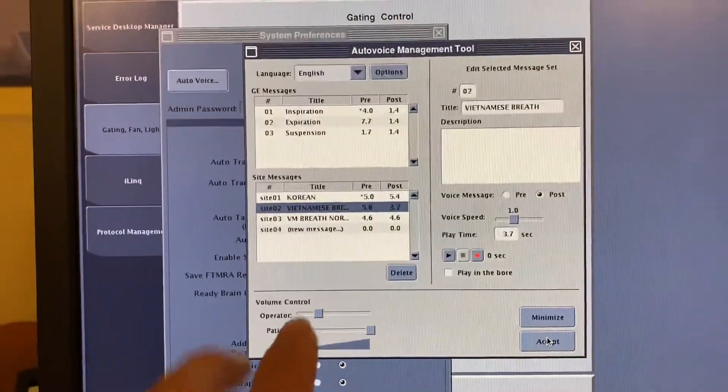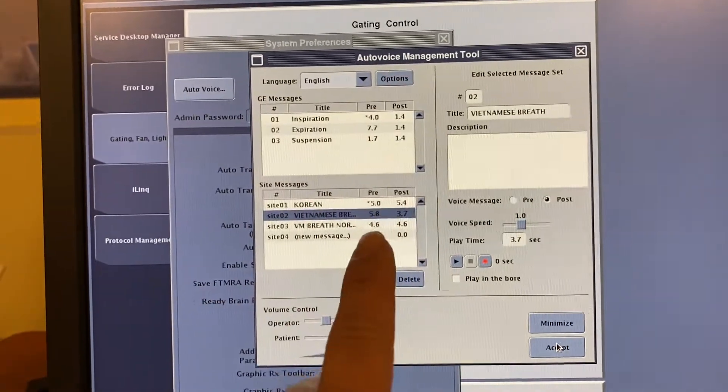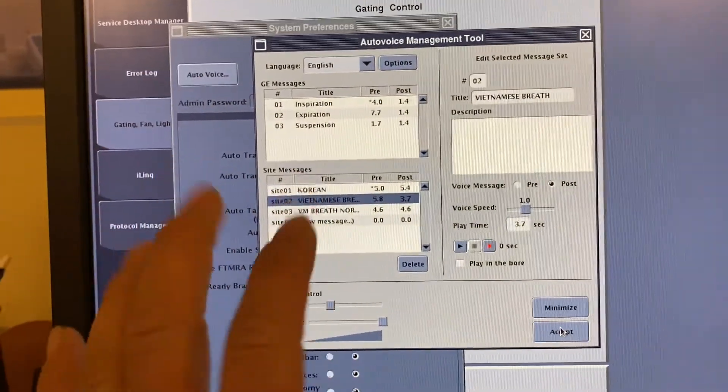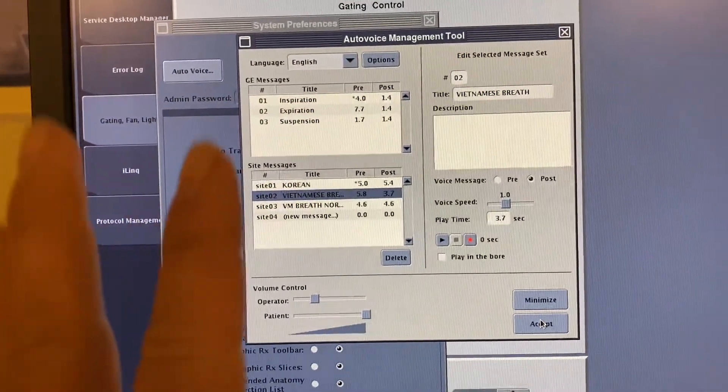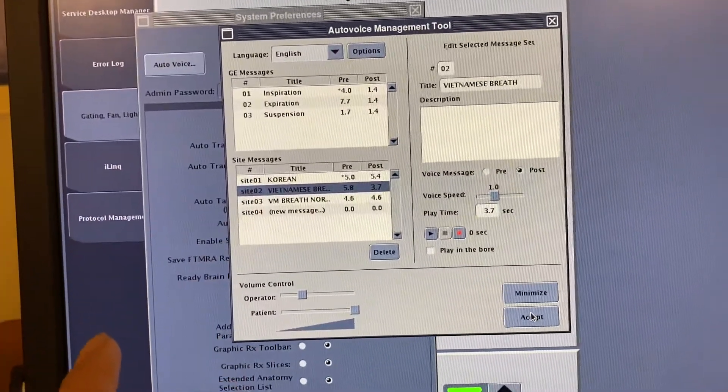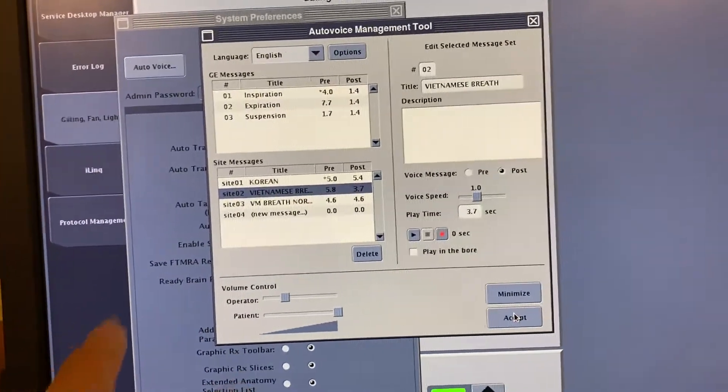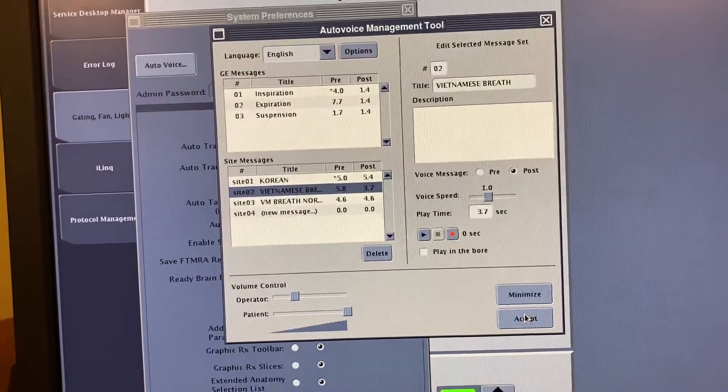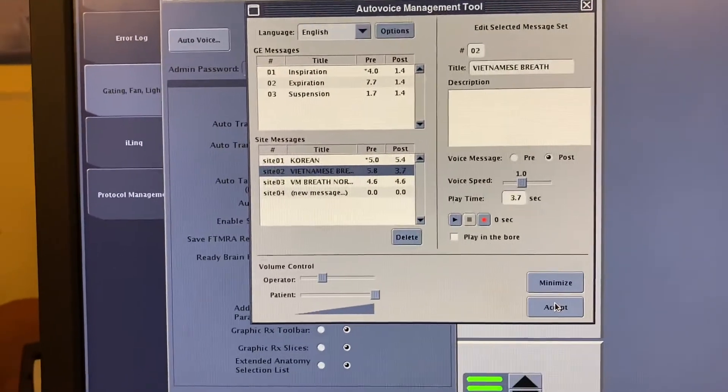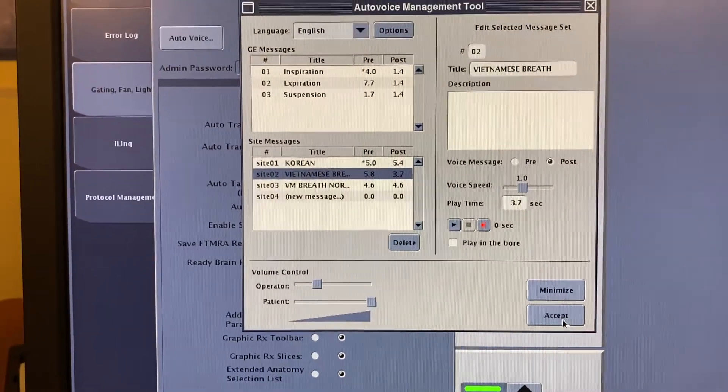One more detail: you can only do this while you have no exam picked. I don't think you can do it on the fly. Like if you had a Chinese patient on the table and you wanted to record Chinese, you need to do this before you pick their session number or their exam.